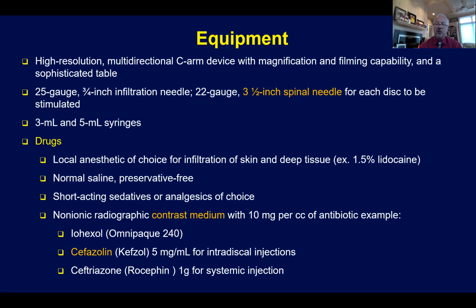And I utilize the curve to be able to steer the needle into position and minimize the requirement for retracting the needle and redirecting it through the tissues. If you've got a nice little 30-degree curve, about 1 centimeter from the tip of the needle, you can steer the needle into the target and avoid multiple needle passes, which can be painful for the patient.